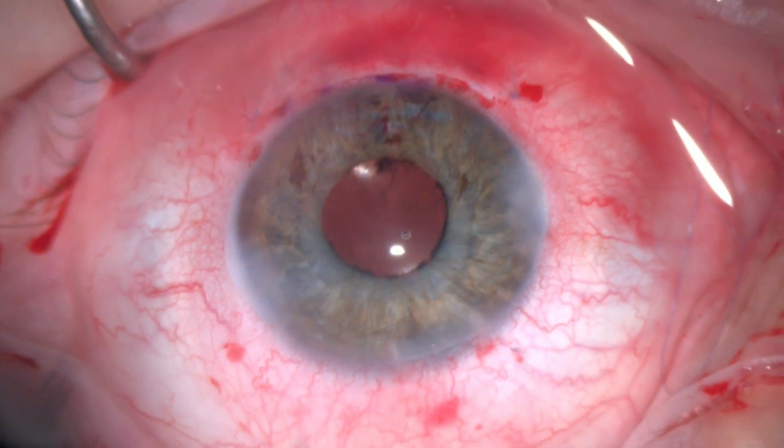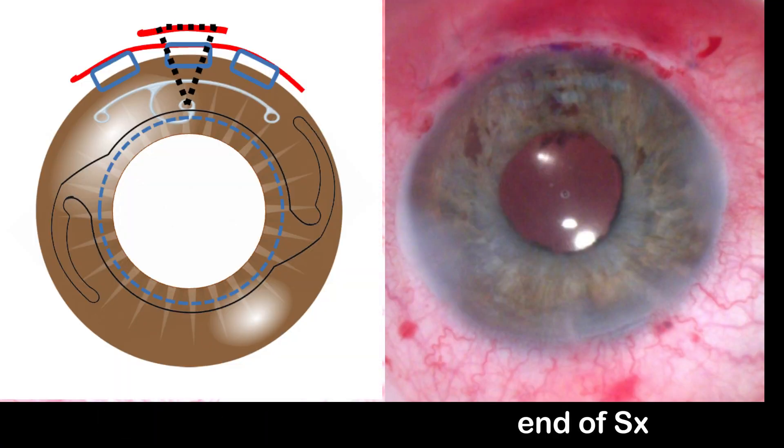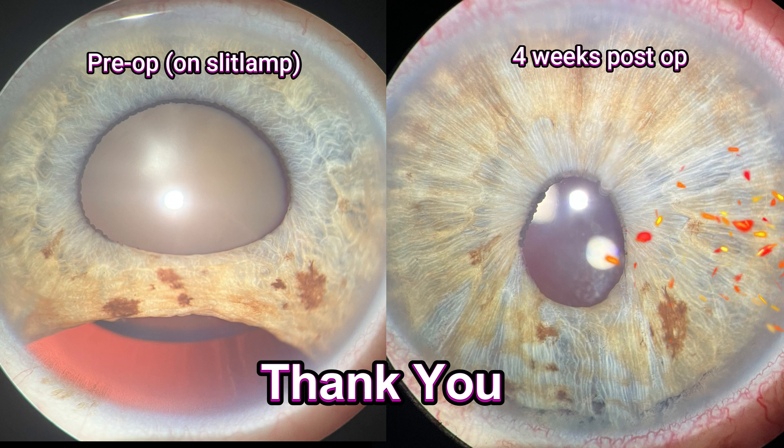And now the pupil nicely has a good cosmetic appearance at the end of the surgery. The final step is to close this conjunctiva with an 8-0 Vicryl suture and hydrate the main incision. The microscope view before and after the surgery shows we addressed the three main problems: the traumatic cataract, the area of the zonular damage, and the iridodialysis repair. I reviewed the patient after the surgery — there is a good cosmetic appearance as well as functional outcome. Vision has improved from counting fingers to 6/9 after the surgery. Thank you very much for watching.